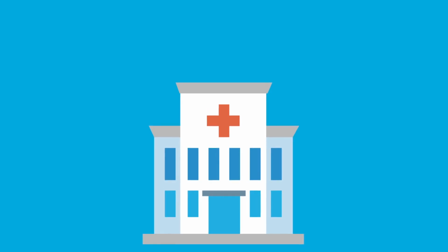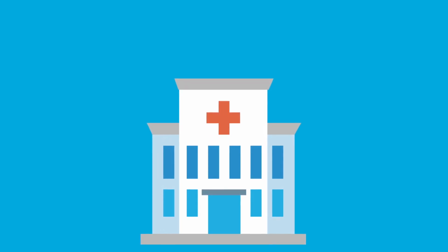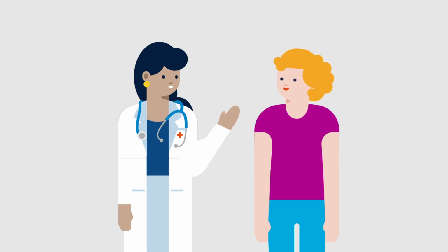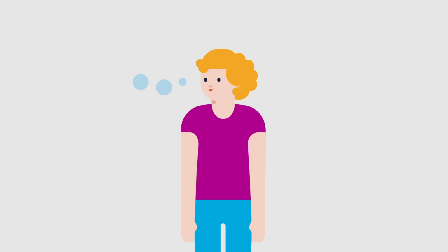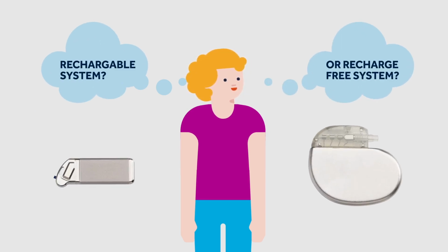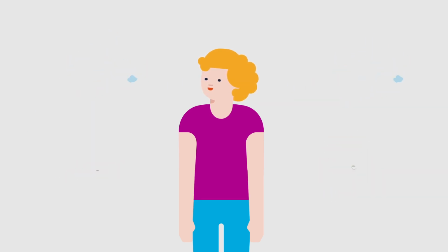The following video will explain to you the implant phase of the sacral neuromodulation therapy. Because the evaluation phase was successful, you may be eligible to receive a permanent sacral neuromodulation or SNM system. There are different versions of the system, and you may have already decided which one is right for you. Together with your clinical team, you will discuss the available options.